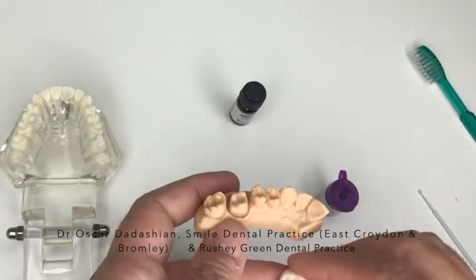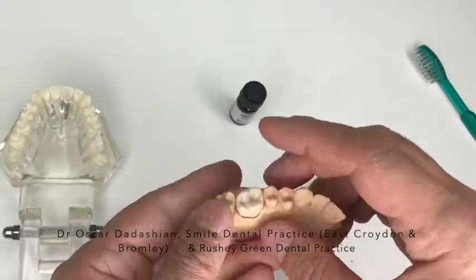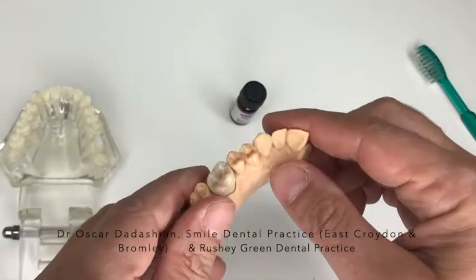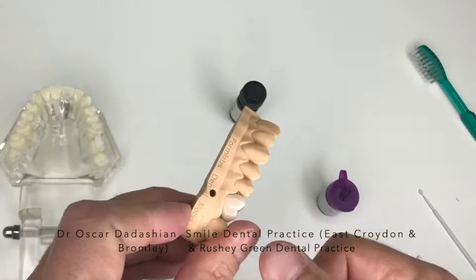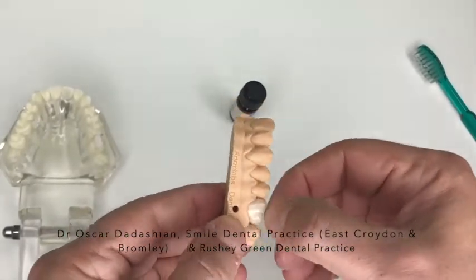We want clean surfaces. You then try your crown in first without anything. You try it in, make sure it goes in, make sure it feels nice and snug. You bite together and make sure that feels comfortable. Only then you're ready to fit your crown back in again.